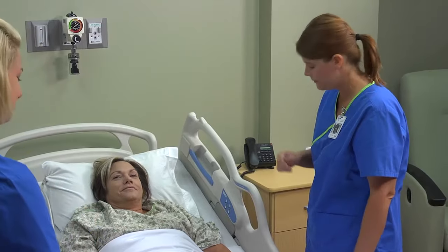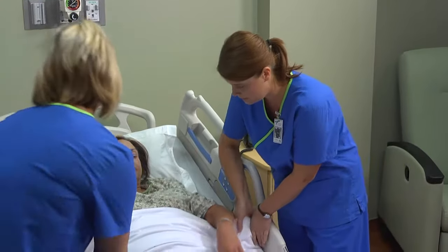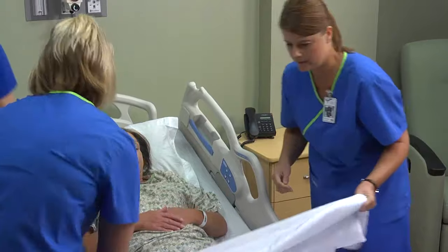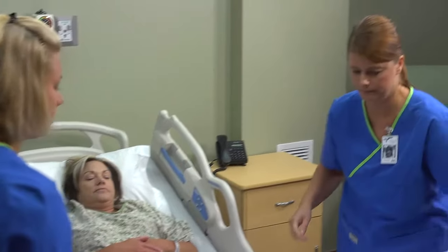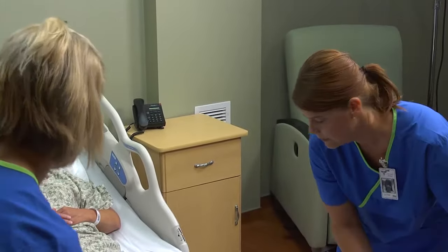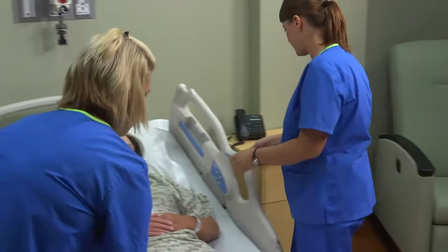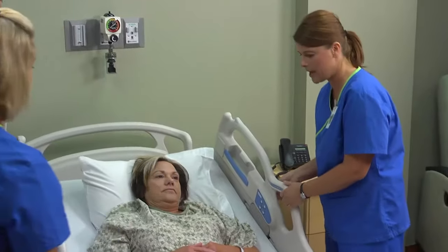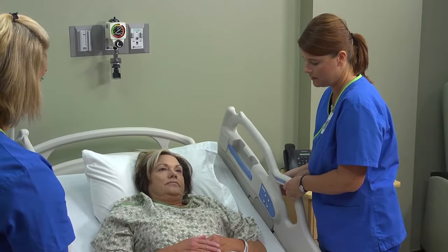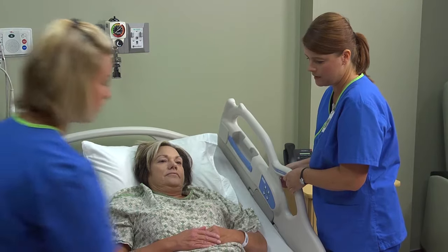To transfer a patient from a bed to a stretcher, obtain a slide board or other friction-reducing device and secure the help of two assistants. A third assistant may be used, if needed, to support the patient's head and neck during the transfer.